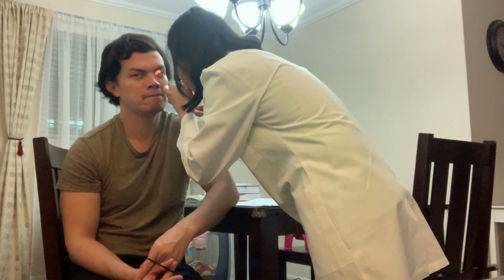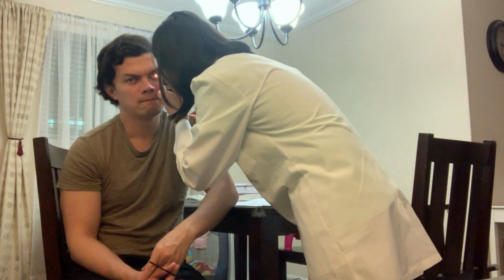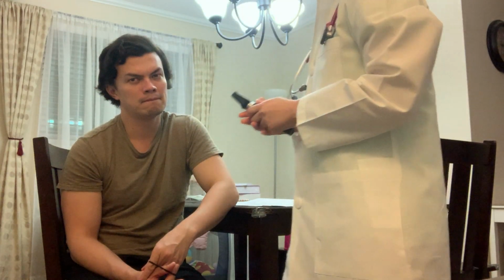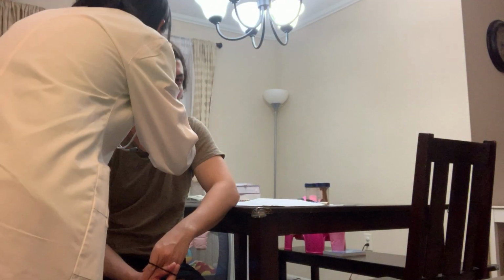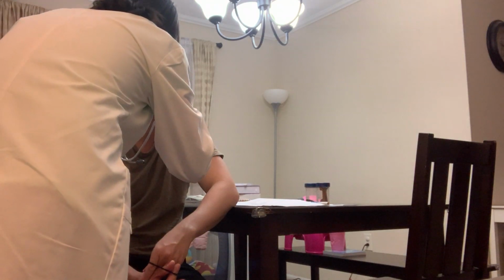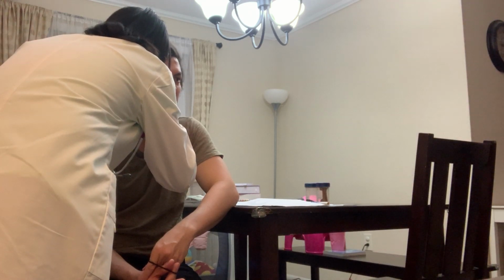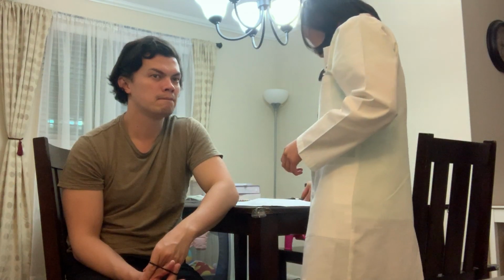Checking for blood vessels, making sure they're intact. Checking the optic disc. Okay. And I would also do the same on the red reflex. Yep, I see it very well. And then on the other side as well. Okay.